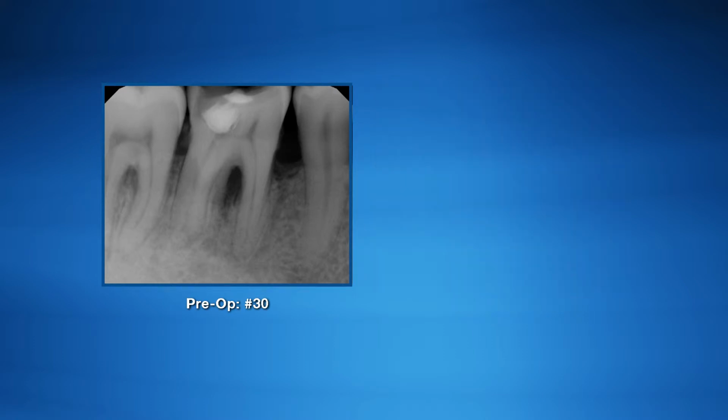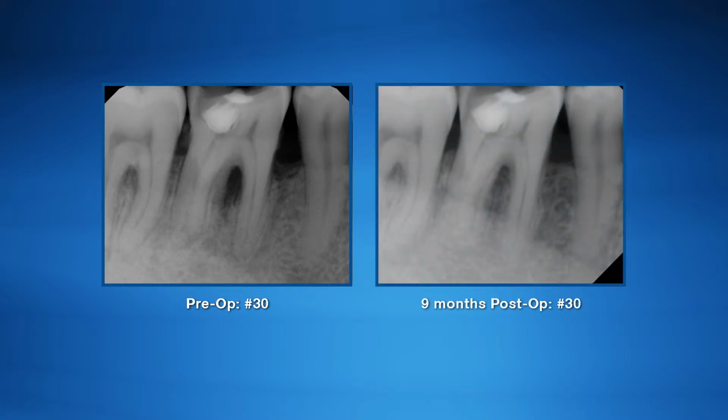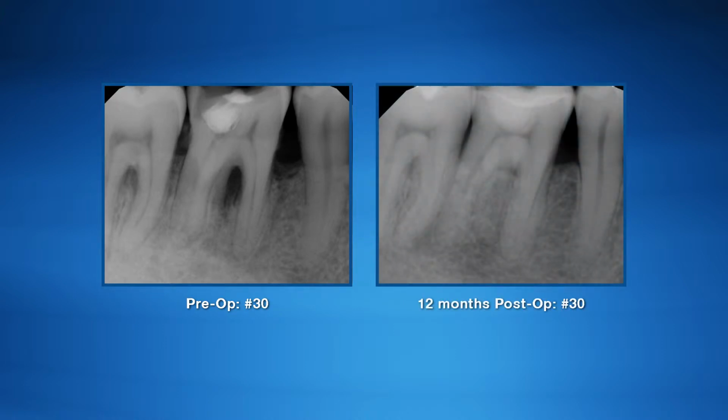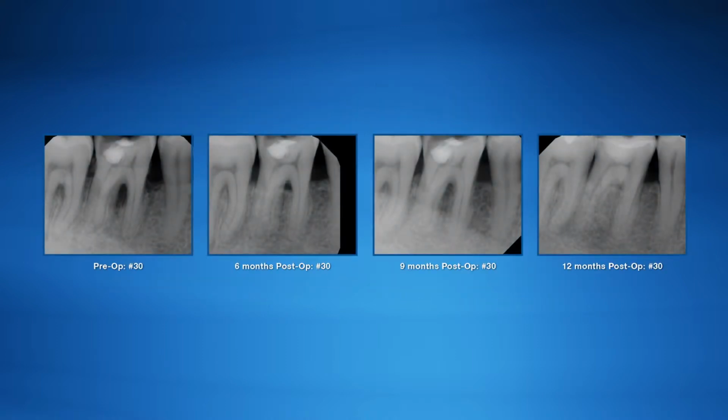At 9 months, we took another one. We see actually some bone growth, and we are excited. At 1 year, we took another one. We see that in a couple of teeth, between the two roots, the bone was very, very low, and now we see the bone completely fills the furcation area.